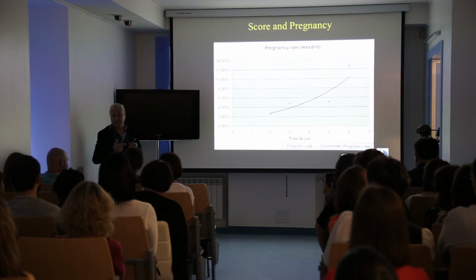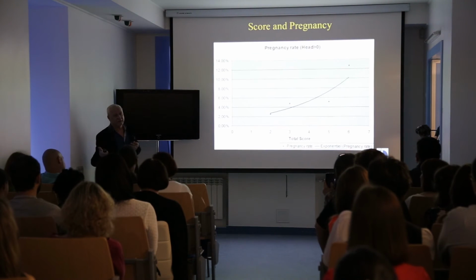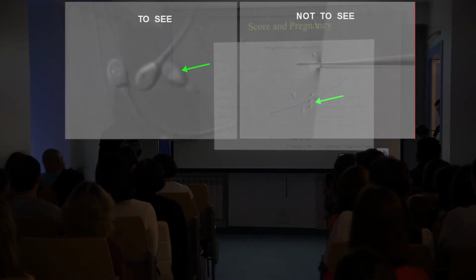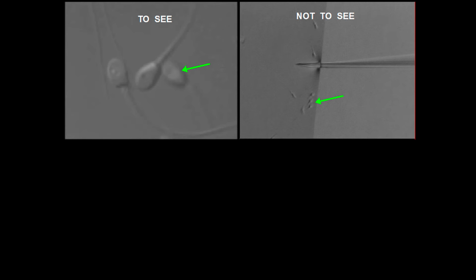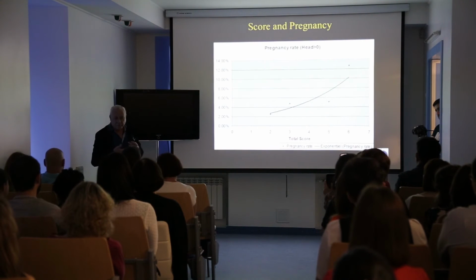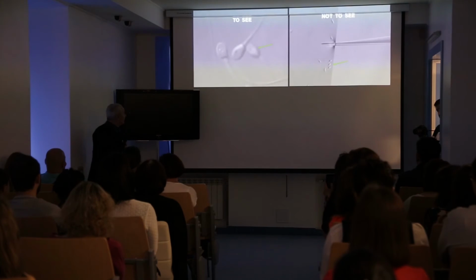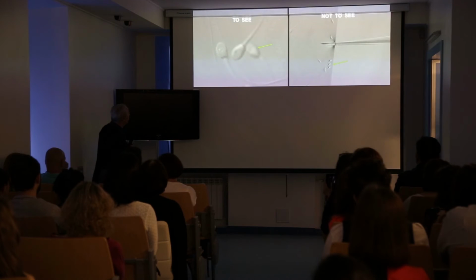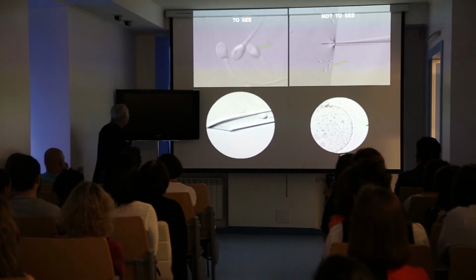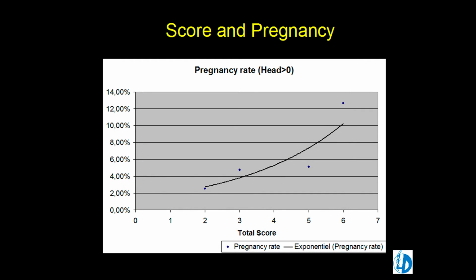We can have a classification, and I know that Pasha is also working in Israel with the labs for that, and he works very well. But I think that science must be to teach everyone and to learn from everyone, not to teach only one person. This is my conception of science. And you see, in this kind, you can see the sperm in high magnification and low magnification.